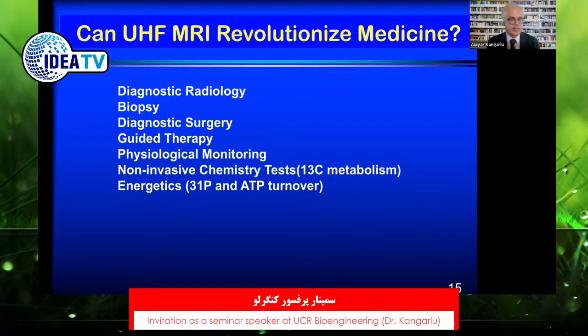Although we have PET, positron emission tomography, and single photon emission tomography, they had a variety of technological problems. Primarily the resolution in PET and SPECT was the problem, and PET and SPECT both are really functional scanners.